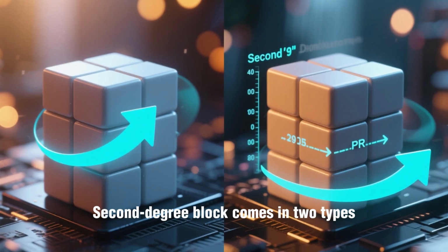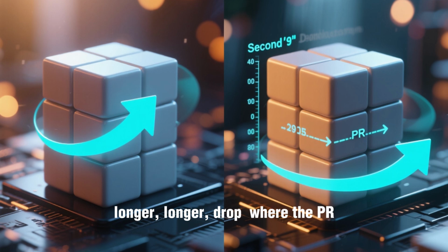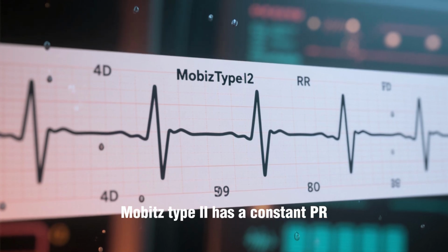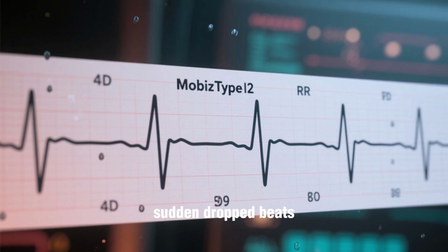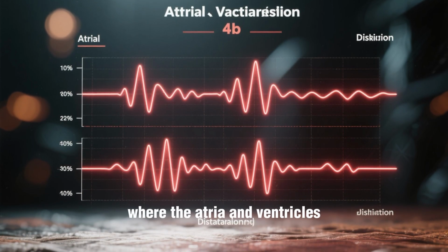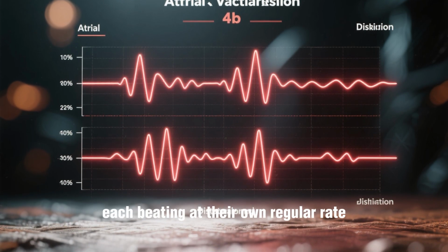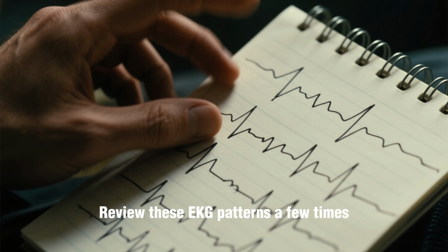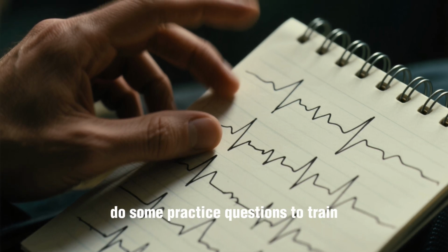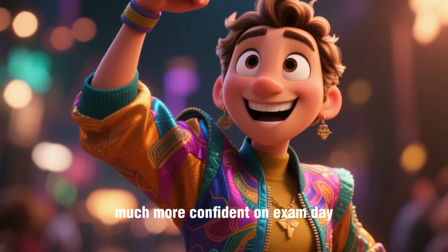Second-degree block comes in two types. Mobitz type 1, or Wenckebach, is longer, longer, drop, where the PR interval progressively lengthens. Mobitz type 2 has a constant PR interval but with unpredictable, sudden dropped beats. And third-degree block: complete electrical chaos, where the atria and ventricles are totally dissociated, each beating at their own regular rate. My advice: review these EKG patterns a few times, do some practice questions to train your eyes to spot them quickly, and you will feel so much more confident on exam day.